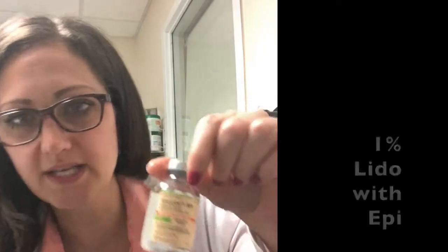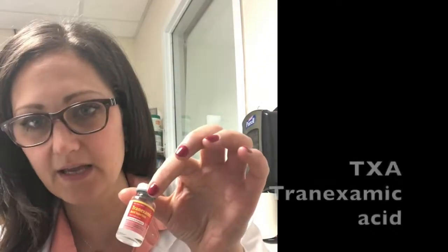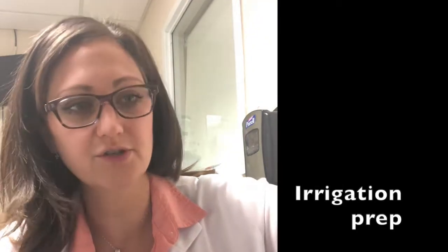You're also going to need some 1% lidocaine with epinephrine and some TXA. The other pieces of equipment you're going to need are a pre-filled 10 ml syringe of normal saline, with an additional amount of normal saline should you need that for additional irrigation.